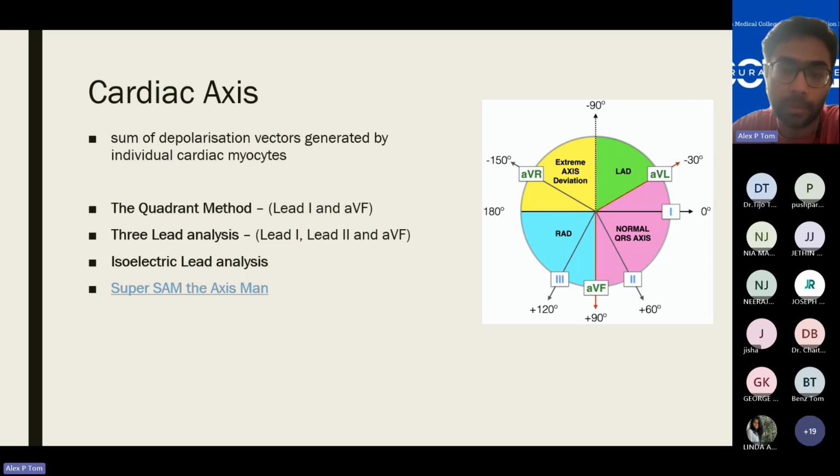So this is lead 1, and then lead 2, it was between the right upper limb and left lower limb. So this is lead 2 being placed here. You just rearranged the vectors, but without changing their value or anything. You just moved it here. So it sits there at 60 degrees. And then lead 3, which was between the left upper limb and left lower limb, just moved it here across. So that's sitting at 120 degrees.